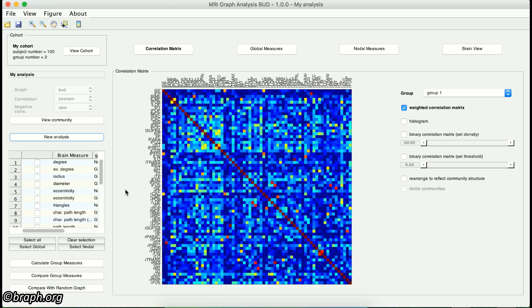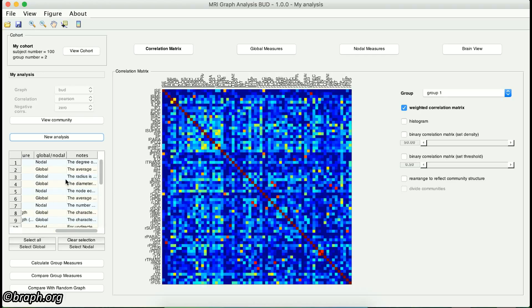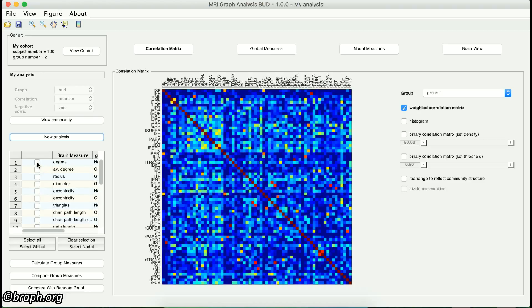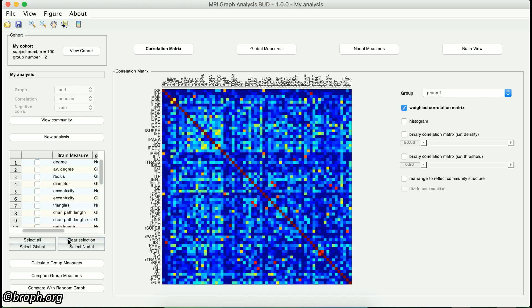Now I'll go back to the left side of this interface. Under the New Analysis button, you can see a list of measures with their types and a brief description in the table. If you want to select any of these measures, you should click on the checkbox provided next to the measure's name. In order to select all of the measures, click on the Select All button below the table. To clear the selected measures, click on the Clear Selection button. If you want to just select global or nodal measures, click on either the Select Global or the Select Nodal buttons.